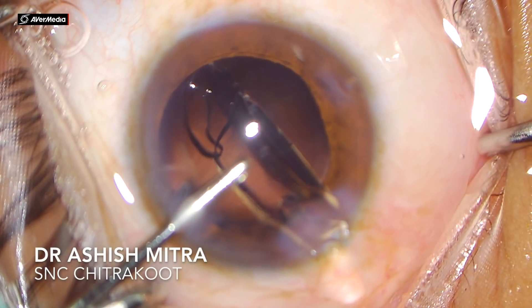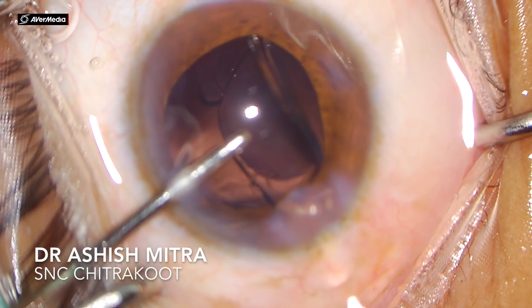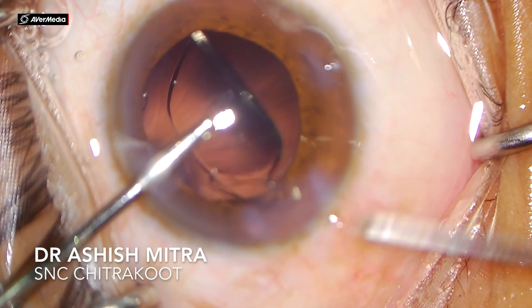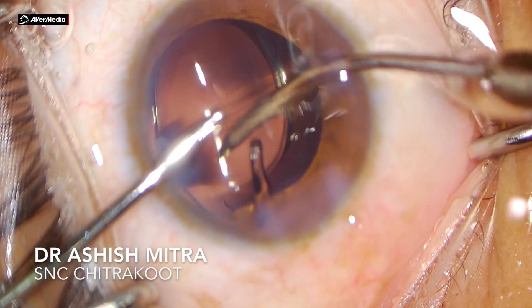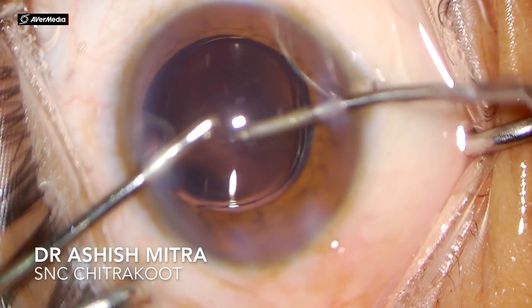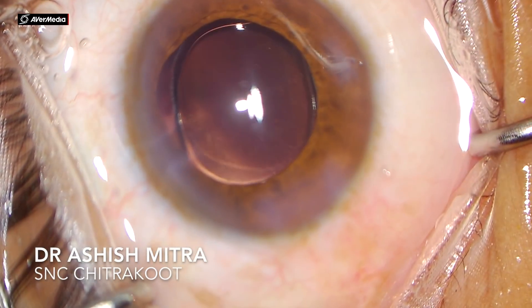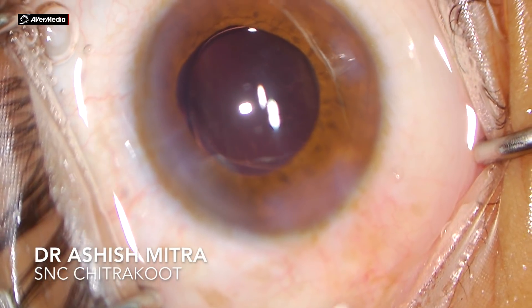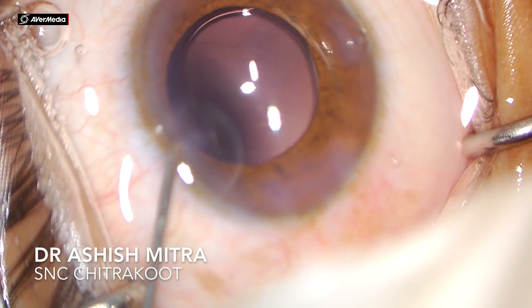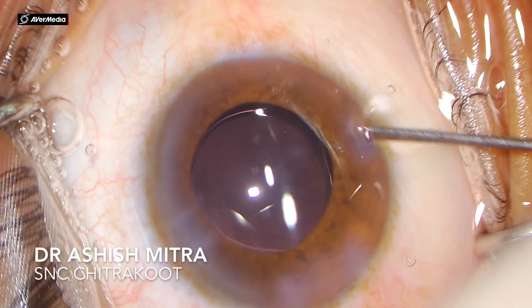I always do hydroimplantation of the lens in my cases. Whatever viscoelastic comes in with the IOL implantation is immediately expelled out through the side ports, because the irrigation port is in place with continuous irrigation. Whatever viscoelastic enters the anterior chamber is actually removed, so you don't really require a visco wash. Once IOL implantation is done, all you do is closure of your wounds. Hydroimplantation of the lens actually saves time and is pretty safe.